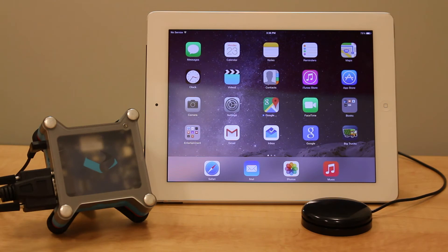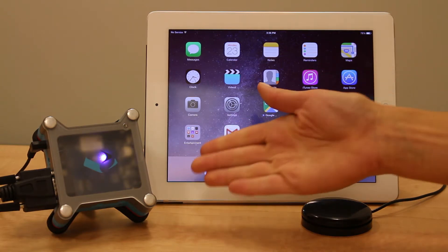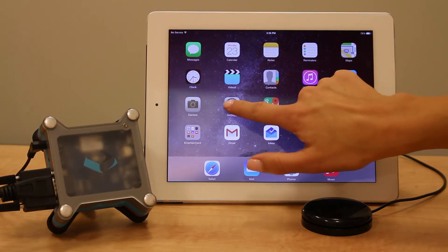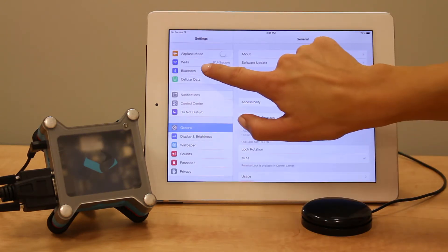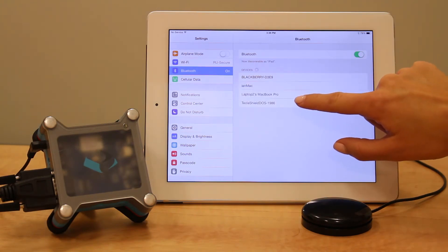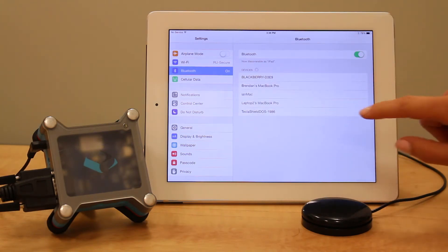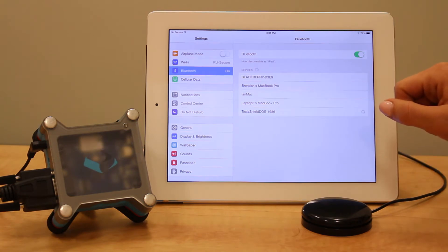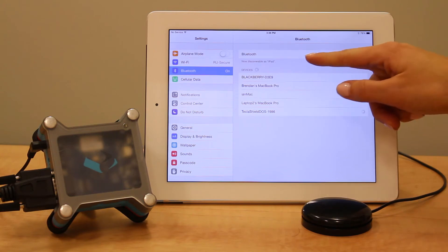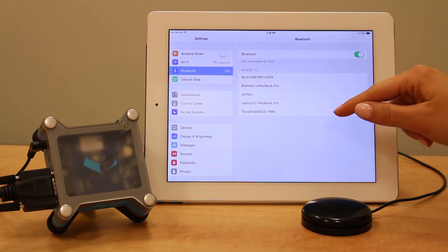To get your iOS device into iOS classic mode, you'll first need to pair your device to your Tecla Shield. Make sure the Tecla Shield indicator light is flashing purple. First go into Settings, click on Bluetooth, and you'll see Tecla Shield Dose along with a few random numbers appear under the list of devices. Select Tecla Shield Dose, and once you see it appear under My Devices as connected, you can proceed to the next step.